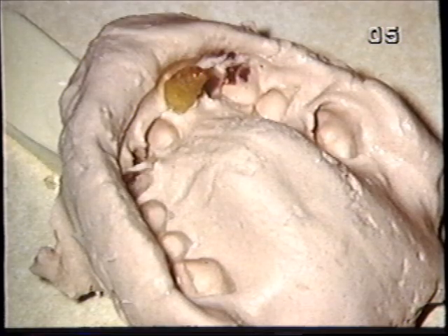Some that should be easy turn out that they're not. This is the type of case that most generalists would not attempt. It's something that would be referred to a specialist. But we don't always know which cases to refer. Some people are hesitant to make a releasing incision to reflect a triangular flap, to reflect the periosteum to get access to bone or root.